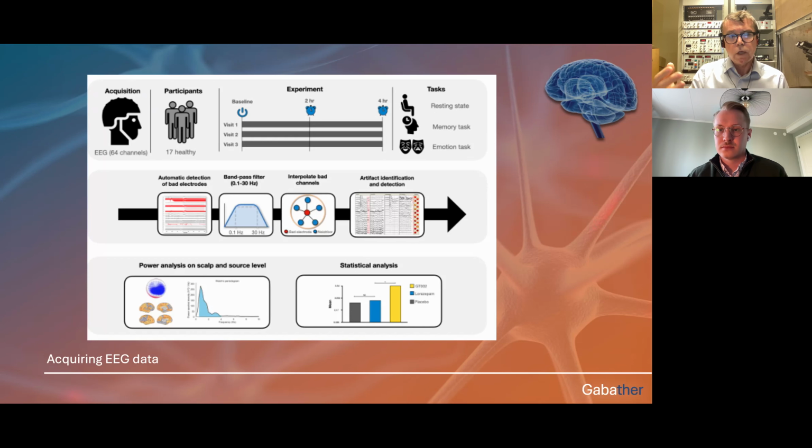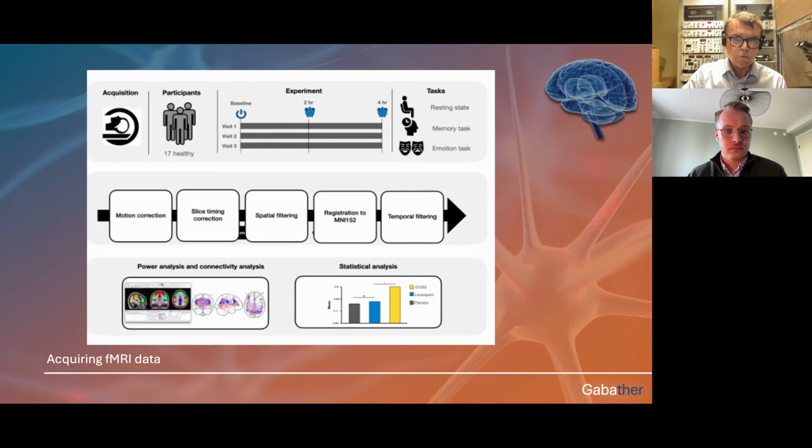So in order to get rid of all this, purely technical data collection, the cleanup process is what you do in the middle row. And then you finally end up with the data at the very bottom. In the case of fMRI, you get imaging data, color pictures, or you get quantitative data like bars, for example. Yeah, like you saw in that slide.